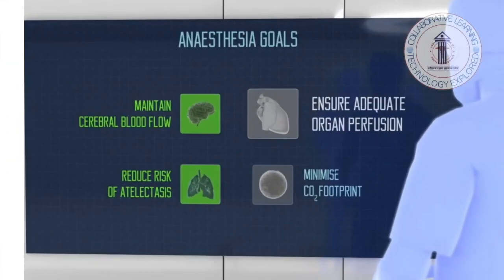Thank you very much, sir. We are actually transforming our anesthesia practice to the era of smart ventilation control, where artificial intelligence enabled systems will take care of anesthetic goals like maintaining the hemodynamic goals and appropriate depth of anesthesia. In spite of all these technological advancements, the minimum monitoring standard mandates that a qualified anesthesia personnel shall be present in the room throughout the conduct of all general anesthetics, regional anesthetics, and monitored anesthesia care.